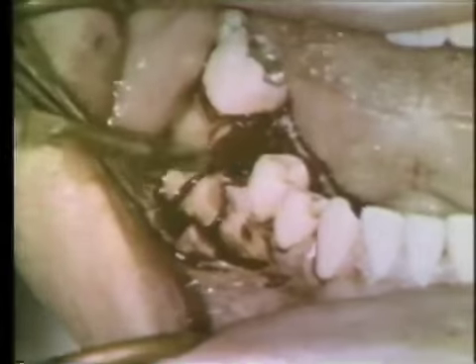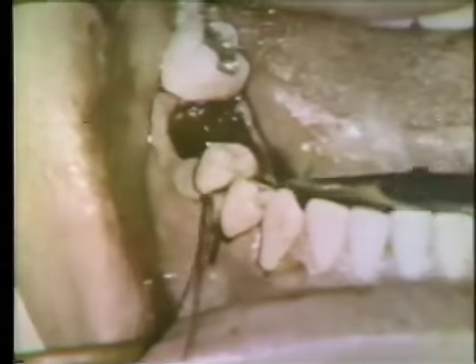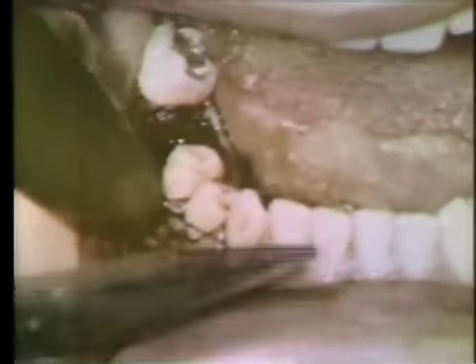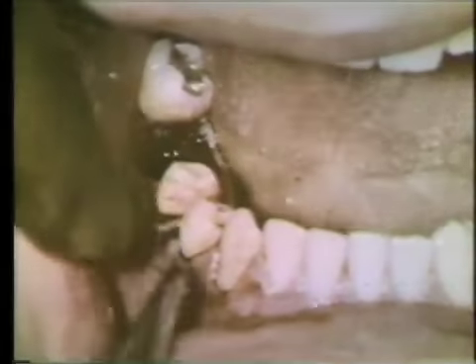The cut then is made down to the level of the inferior alveolar nerve. The buccal cortex can be marked to a slightly lower level, but the flaps then are closed in this two-stage operation. This is only one of the several manners in which this ostectomy can be performed. It is a rather useful and conservative way to perform the operation.